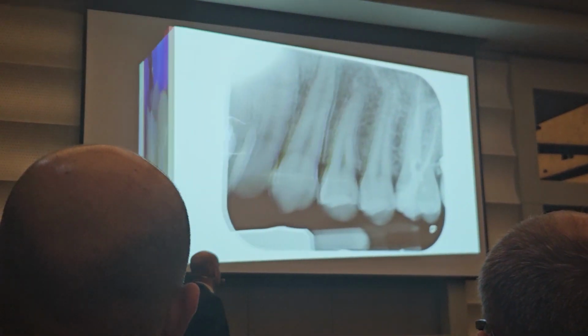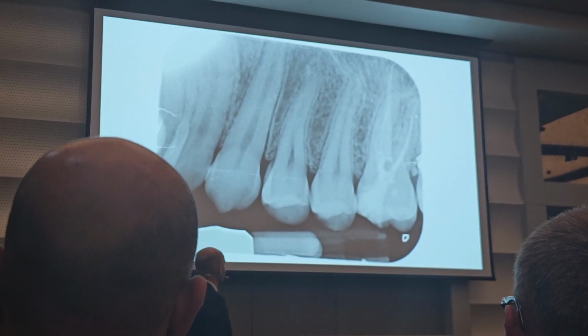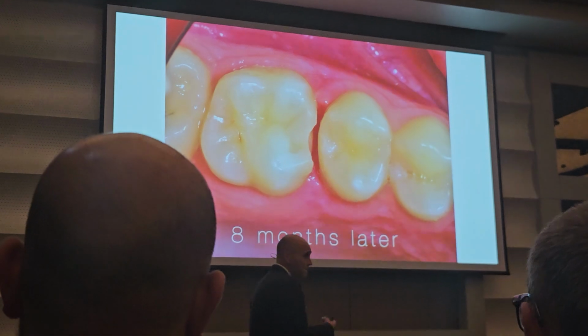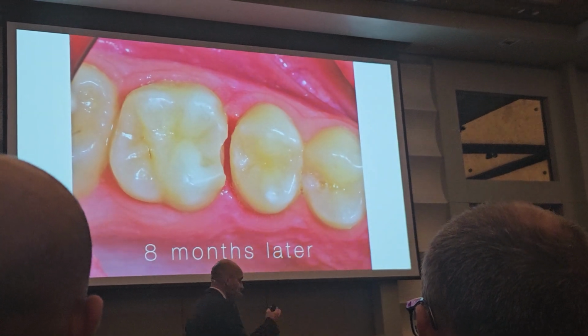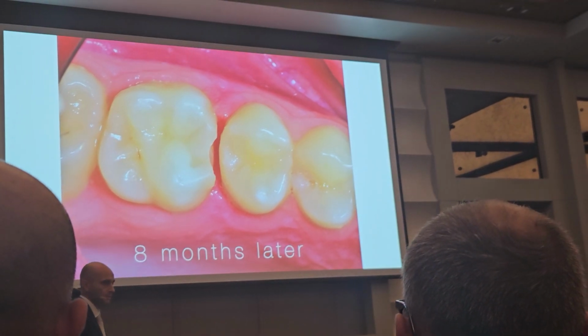It looks nice. Minimally invasive dentistry, minimally invasive endodontics. But then after 8 months, the crack. So I had many of them. Some are 2 years, some are 3 years, some are 4 years. But always the reason is the wrong matrix. Okay? Always.